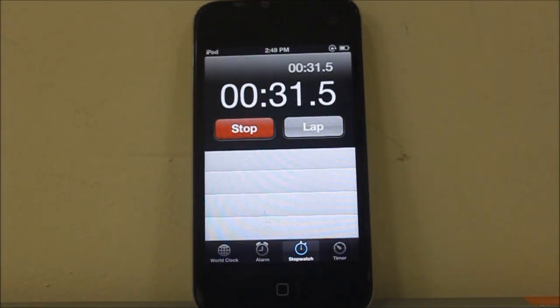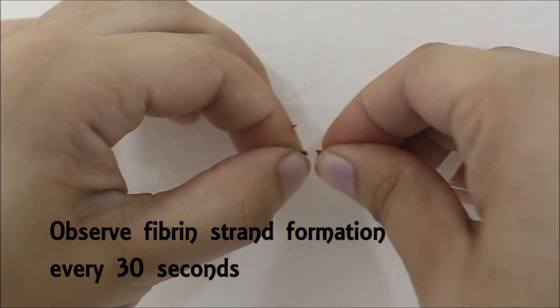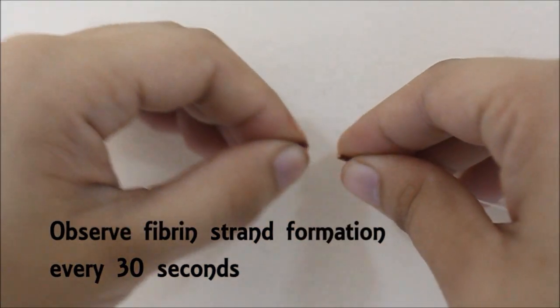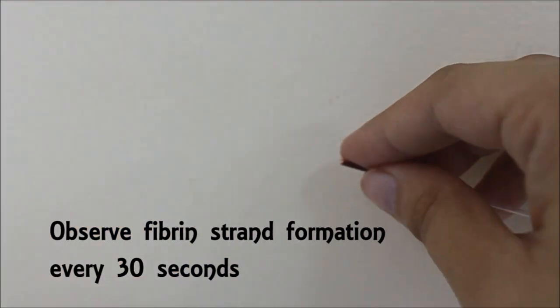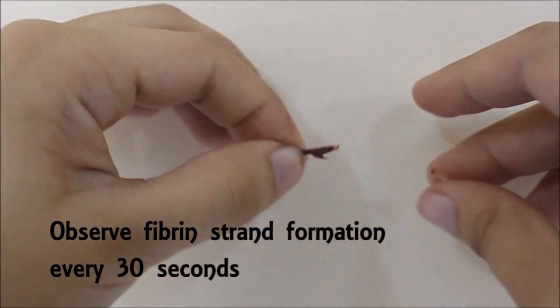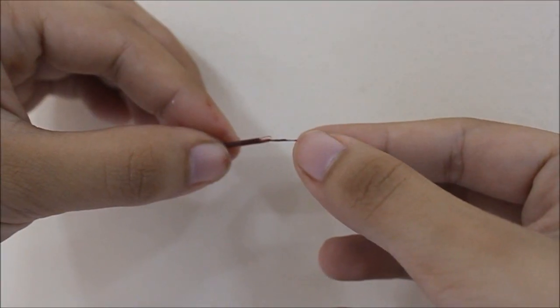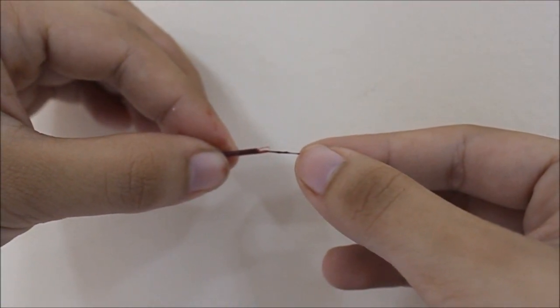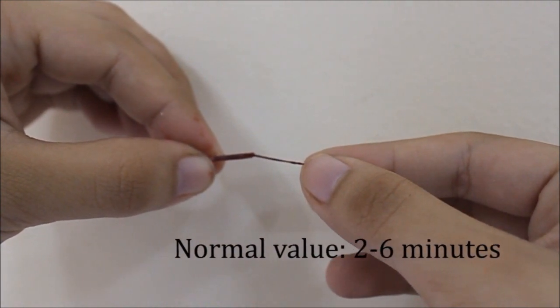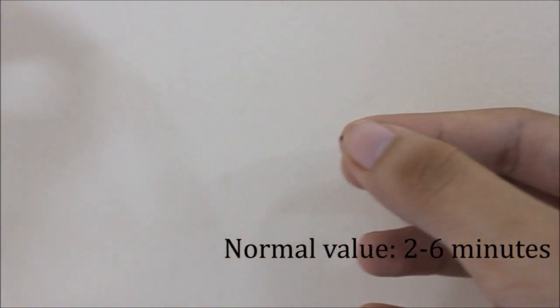At 30-second intervals, break off a piece of the capillary tube gently. Take note of the formation of a fibrin strand that fills in the gap between the capillary tube and the broken piece. The time that elapses is taken as the clotting time. The normal value for the capillary method is 2 to 6 minutes.